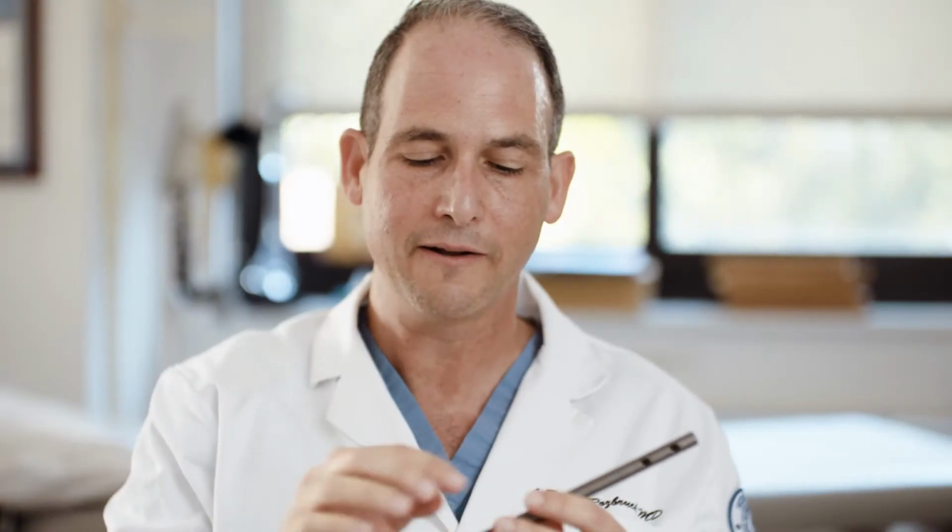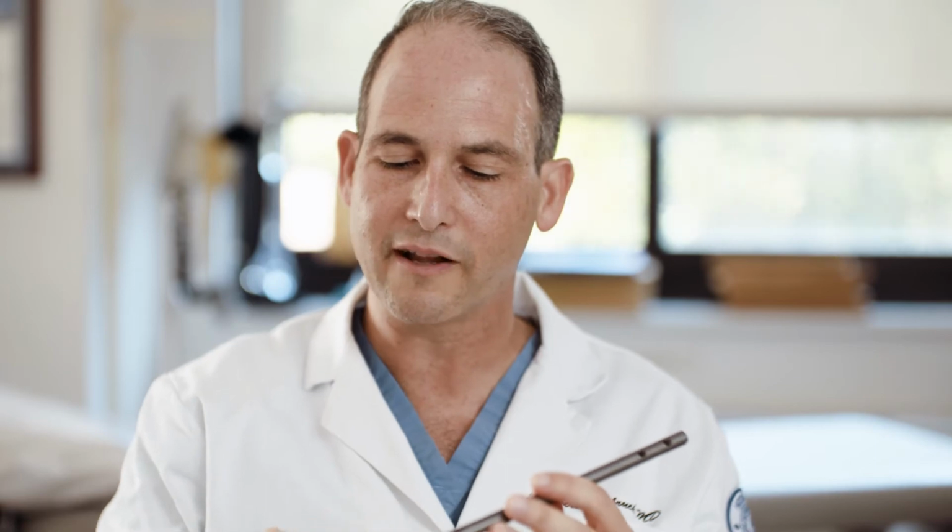So I gotta get another one of these frames put on? He says, no, they have this new nail out that the nail lengthens internally. There's no wires going through your skin. The PRECICE nail is a fully implantable internal lengthening intramedullary nail. There's nothing sticking out of the leg, there's no external fixator. There's a magnet in here, and then there's gears in here, and here's the telescopic rod.